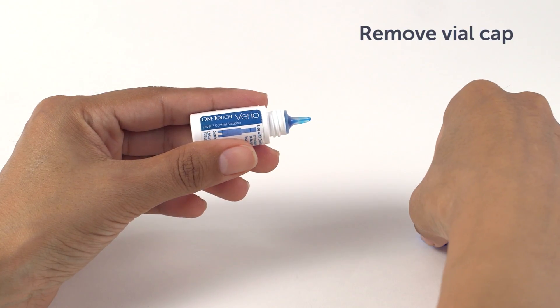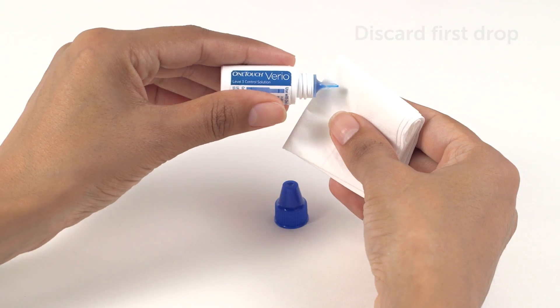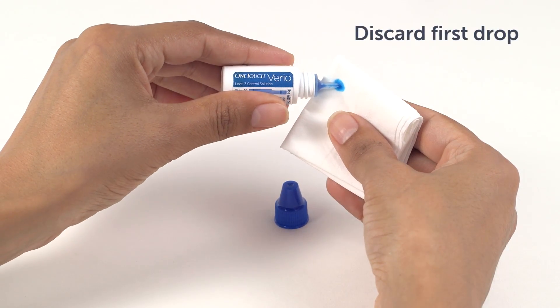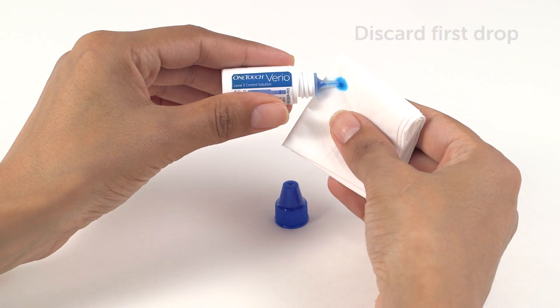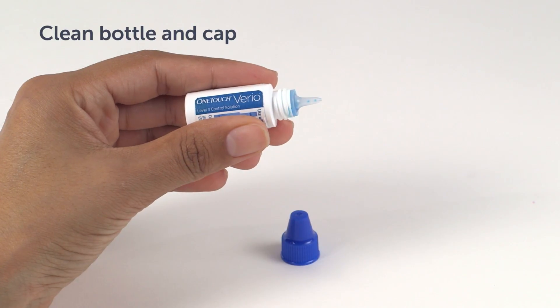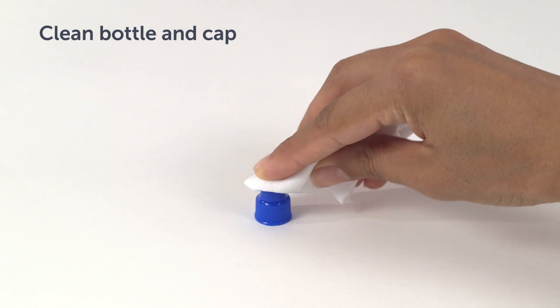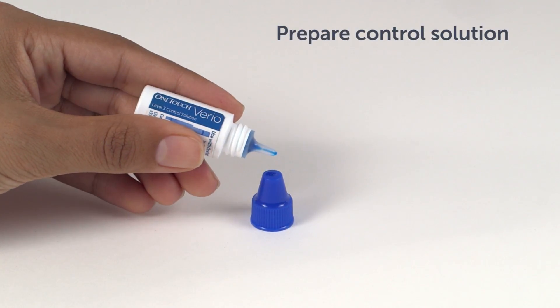Remove the vial cap and place it on a flat surface with the top of the cap pointing up. Squeeze the vial to discard the first drop. Do not swallow or ingest Control Solution. Wipe both the tip of the Control Solution vial and the top of the cap with a clean, damp tissue or cloth. Then squeeze a drop into the small well on the top of the cap or onto another clean, non-absorbent surface.